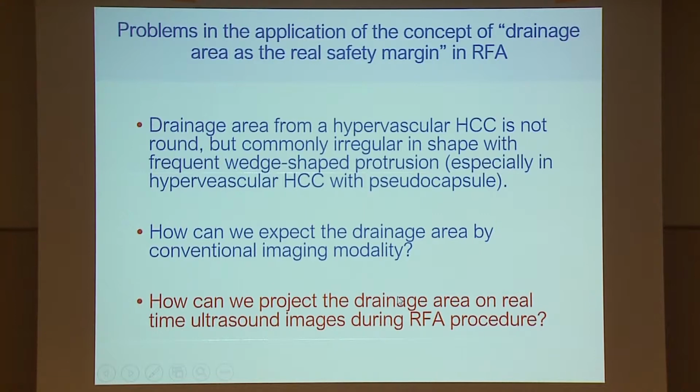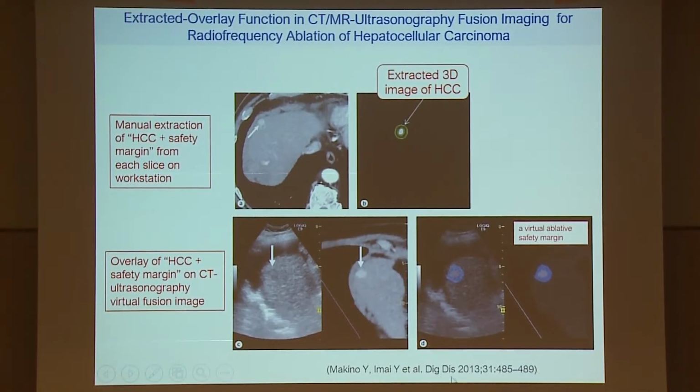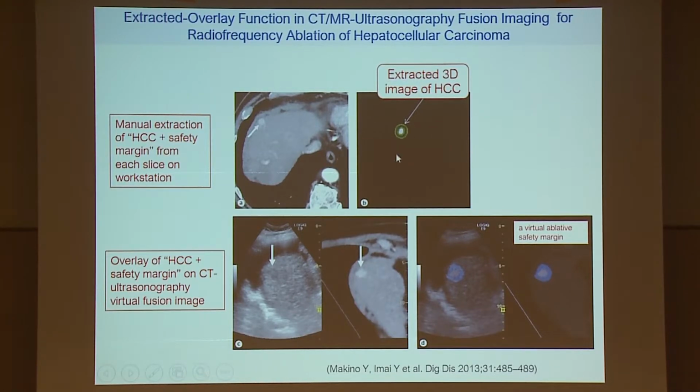I'm not specialized in ultrasound, so previously a doctor in my group published a very interesting technique, the extracted overlay function on CT, MRI, ultrasonography, fusing image for radiofrequency ablation for hepatocellular carcinoma. They extracted tumor stain and suspected drainage area, and this area can be superimposed on the real-time ultrasound.